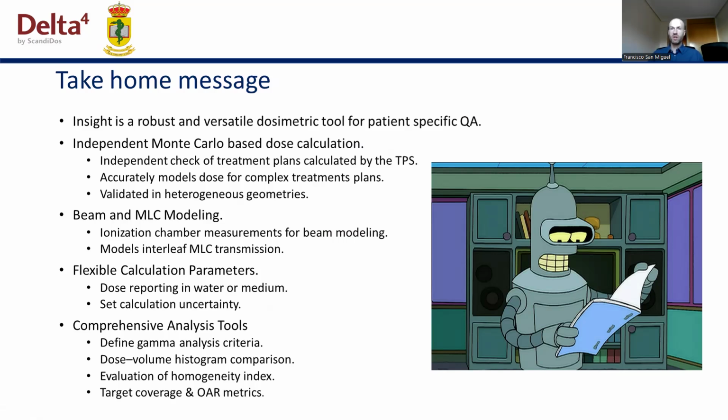Given that Monte Carlo is considered the gold standard for dose calculation, having a second independent plan calculation also based on Monte Carlo, but using a completely different calculation engine, seems to us like an excellent approach for plan verification. Although some slight discrepancies are to be expected, of course, if two different Monte Carlo algorithms yield similar results, it increases confidence that the calculated dose is accurate.